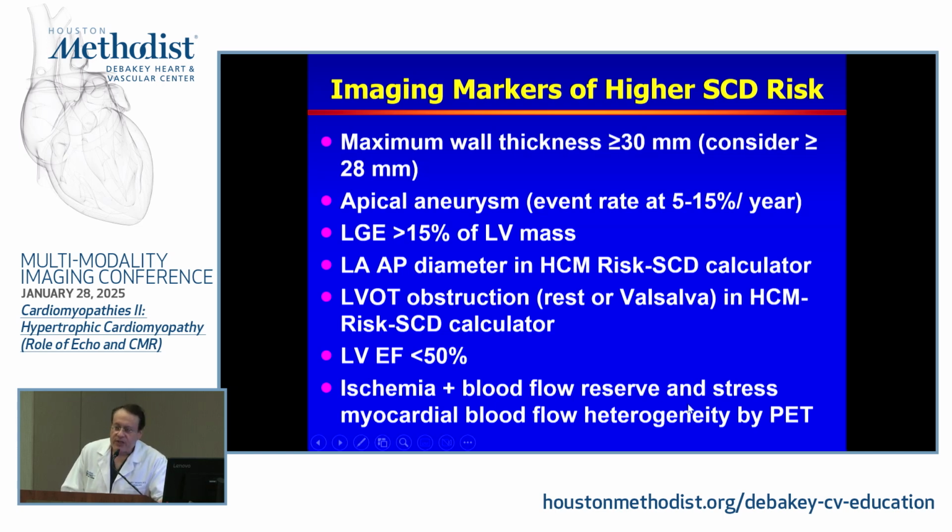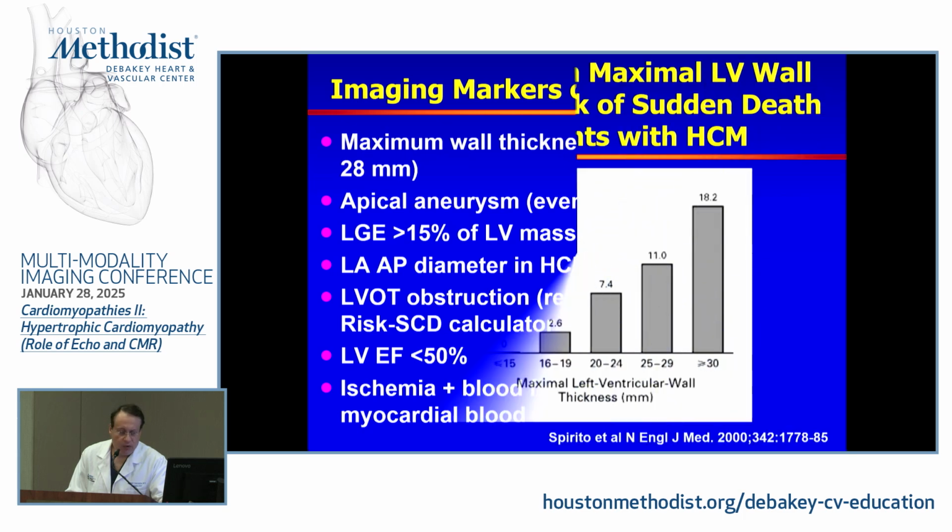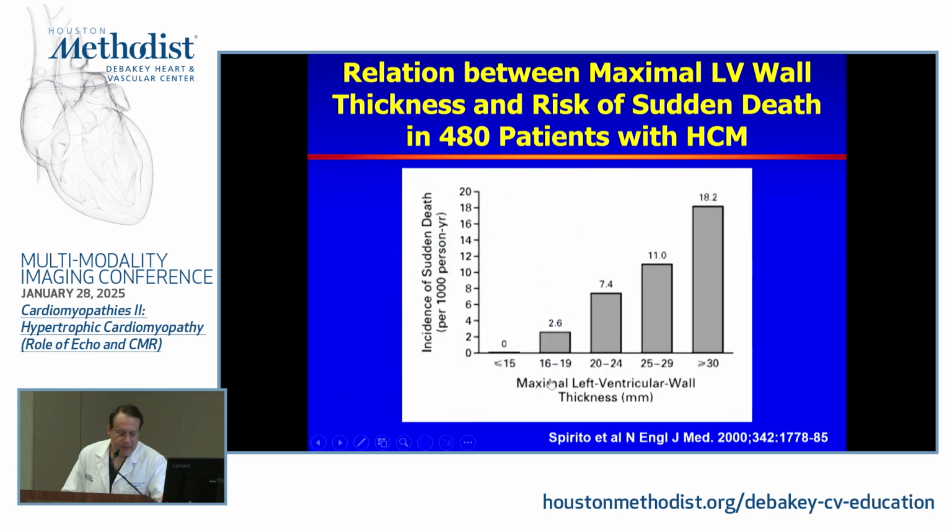There are very small studies that looked at the presence of ischemia and reduced blood flow reserve by PET, and that was associated with worse outcome events. These have not been repeated. As a result, we do not routinely send patients to look for the presence of ischemia or flow reserve by PET. That shows you the data for the increased wall thickness.